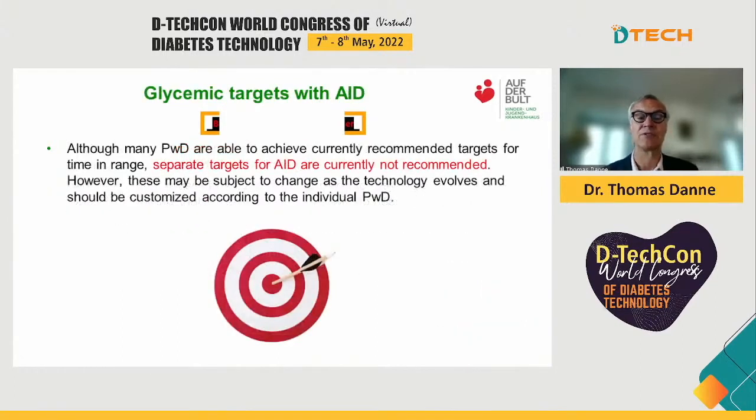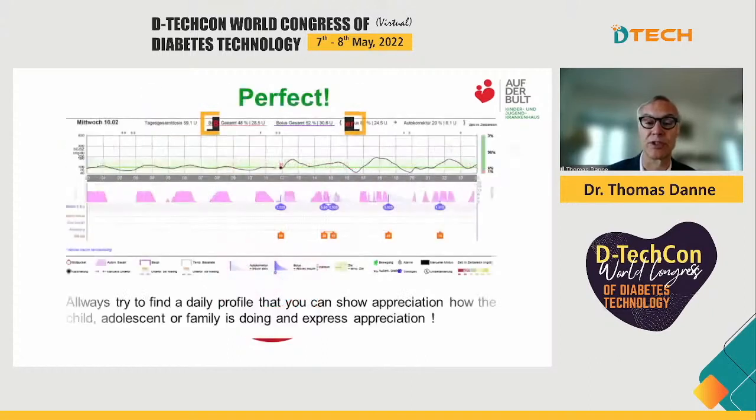We don't have separate treatment goals for AID, as I have shown in the beginning. It is quite amazing how much time in target patients are able to reach with this technology. But currently, we don't have separate goals for these patients.